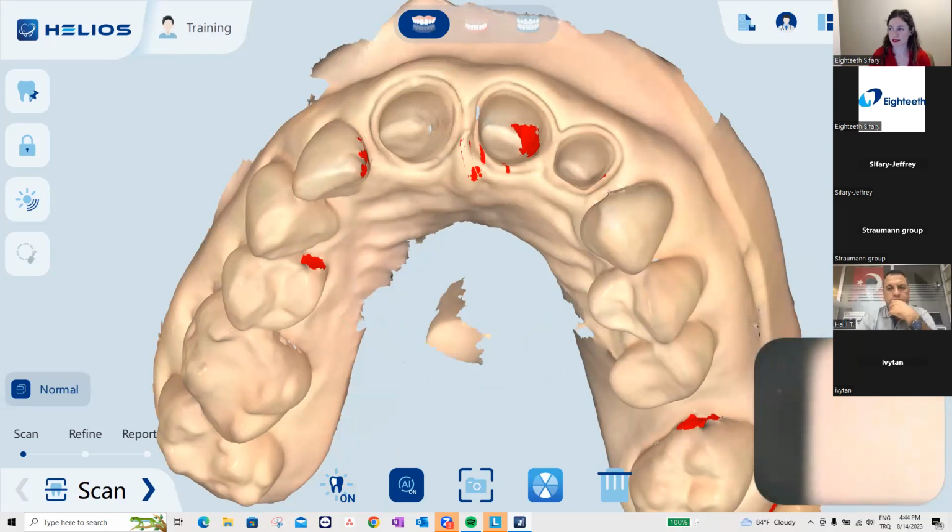There's a scissor cut tool. If I didn't like somewhere, but I like the other tooth preparation scan areas, I can click this and make a circle wherever I'd like to rescan, maybe a bigger one will be better. Just a second. Yeah, like this. And what happens now? I can retake only this area.